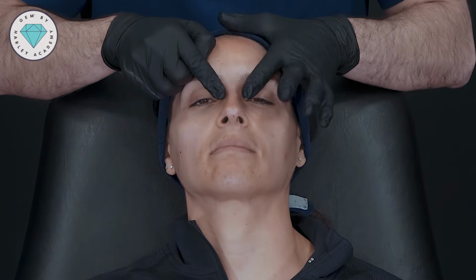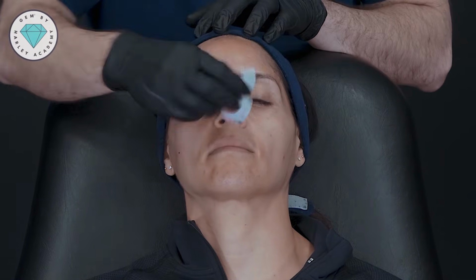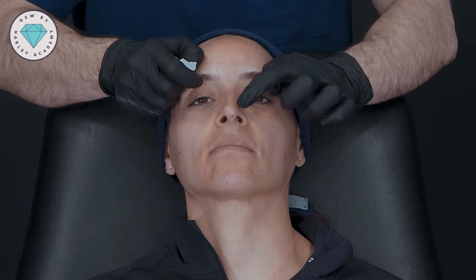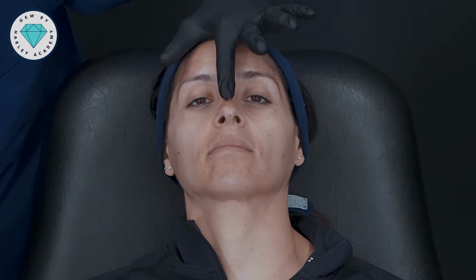One last look from the top, and I'm very happy with the symmetry, the balance of the nose. I've also created a little bit more balance to the tip of the nose where the cartilage is a bit more projected on this side than the other. From the side, and now straight in dorsum. Let's see forwards, Lara. So look straight into that camera for me.